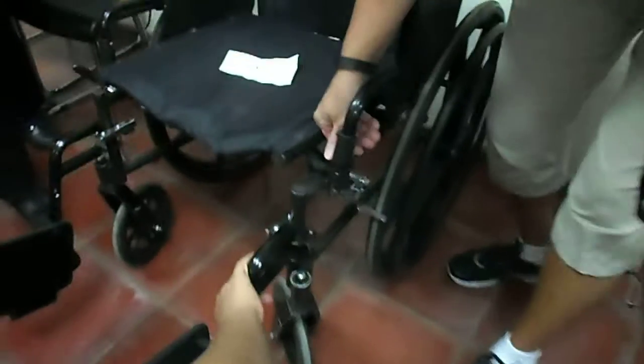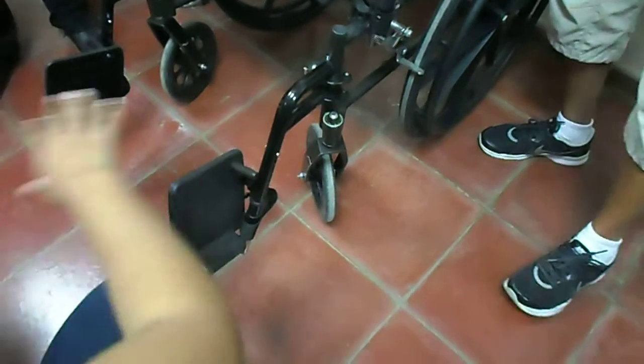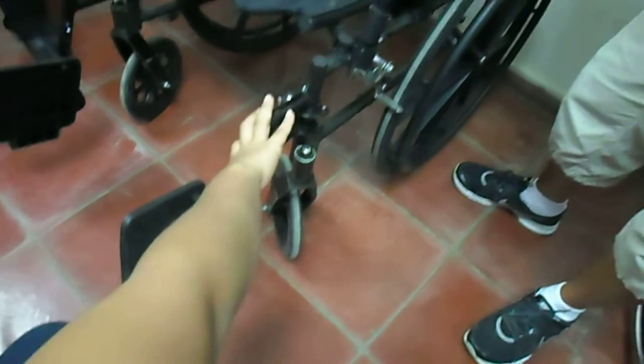This side, for example, is an example of the side that can be transferred constantly. This type of side can be removed. This is for people who need to be passing from one place to another. This one can be removed so that it doesn't hurt.